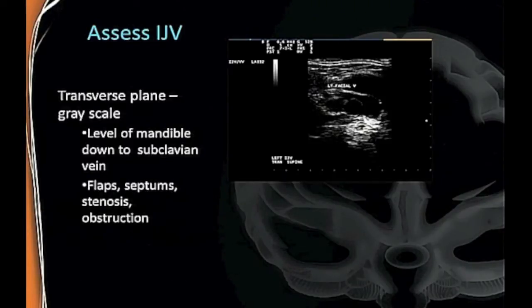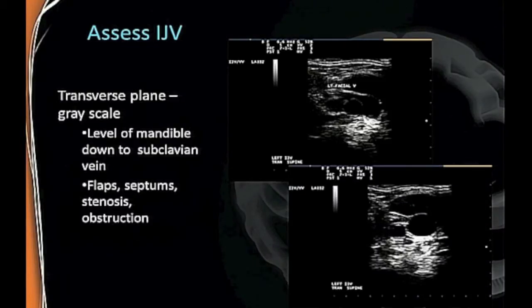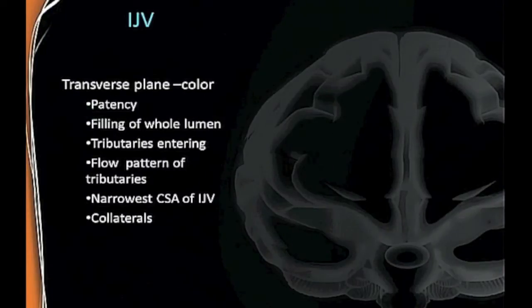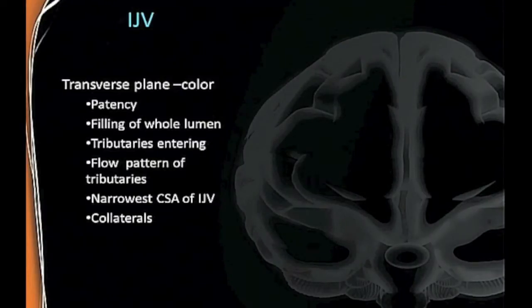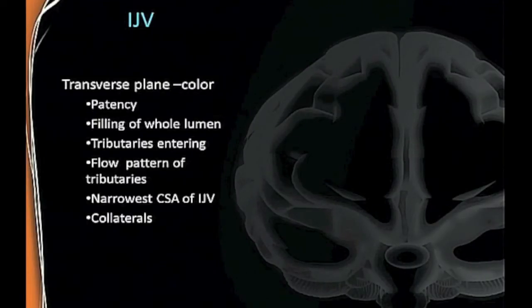Here you can see the left facial vein entering the jugular. Then in color, you're going to look for patency—you want to see the whole lumen, look for flow patterns in the tributaries, and identify which is the narrowest point. You're going to pan from top to bottom in color to check and also look for collaterals at the same time.